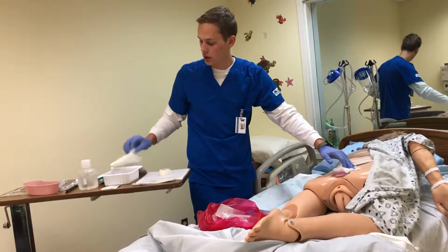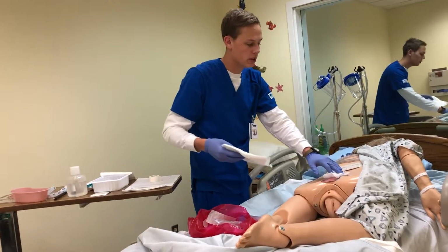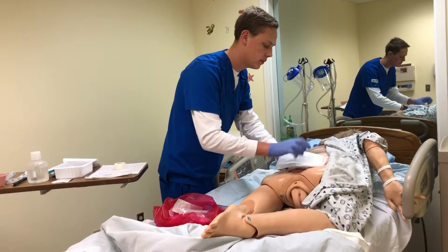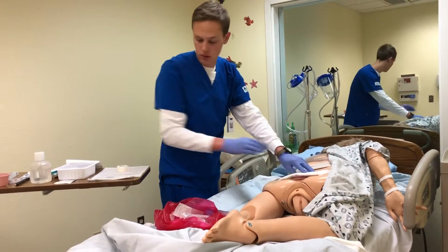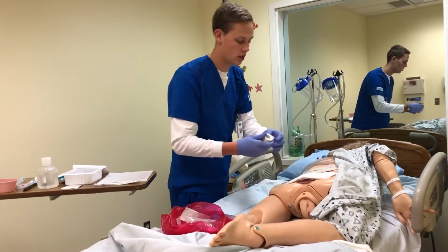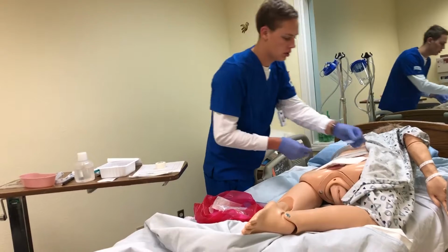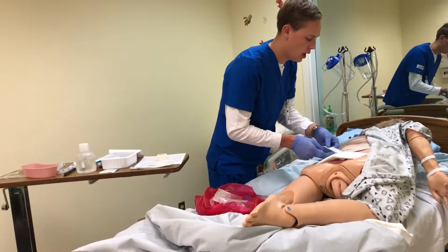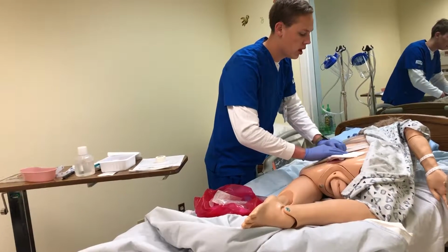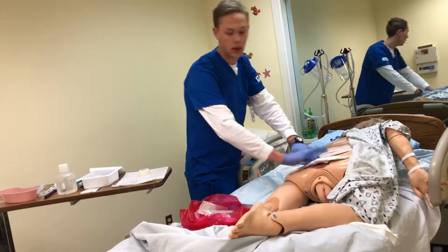Just make sure that's ready. And then this is the cover pad here. I'm going to make sure to have the blue line up. Let me just get a piece of tape out. And then when I tape it, I want to make sure to have at least a half inch to a full inch on the skin so that it has a good seal and contact.